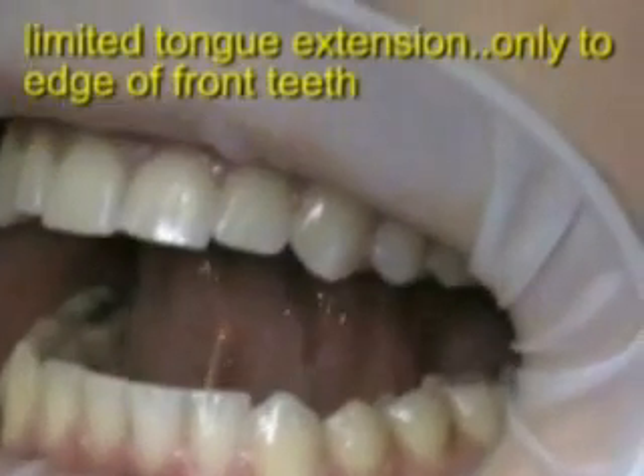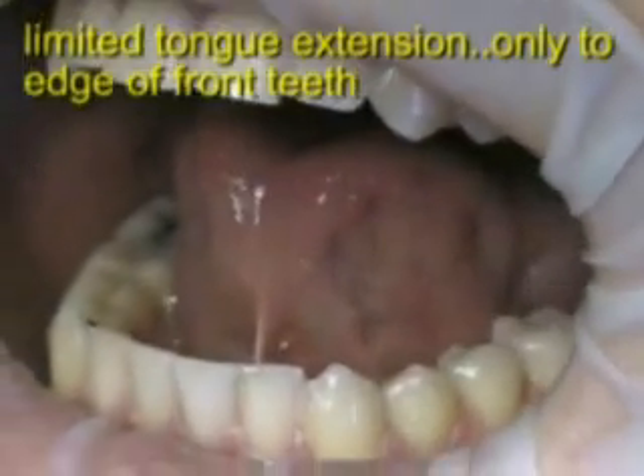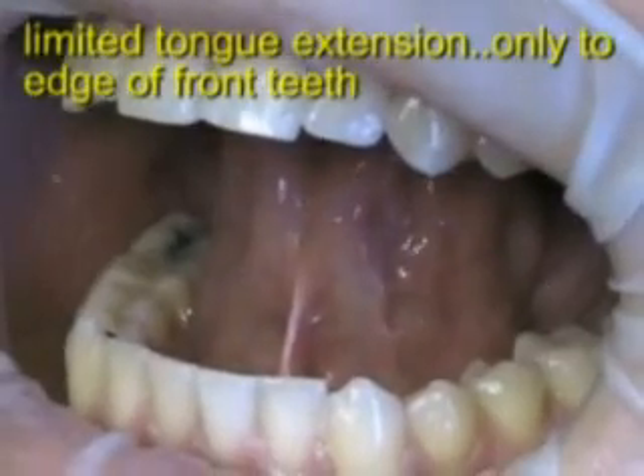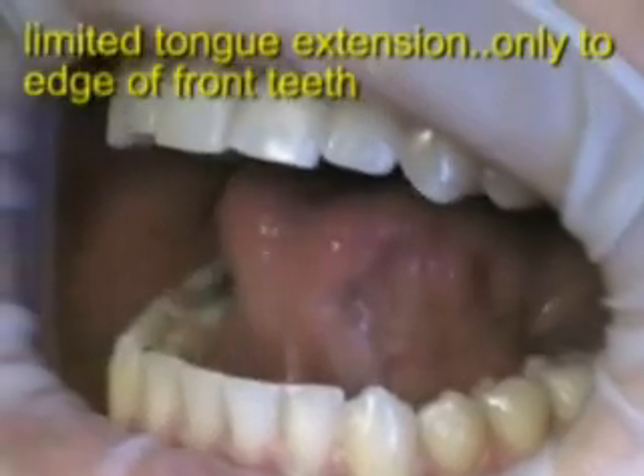This is a tongue-tied patient, and what that means is that there's a lingual frenum — a band of muscle and connective tissue — that has limited the movement of his tongue throughout his lifetime. Usually we see this earlier on because it becomes a speech problem early on in life.